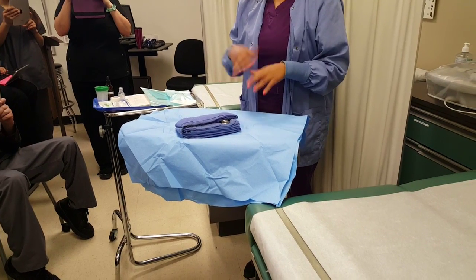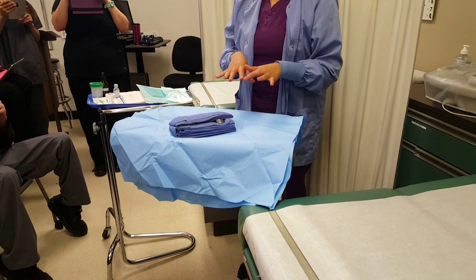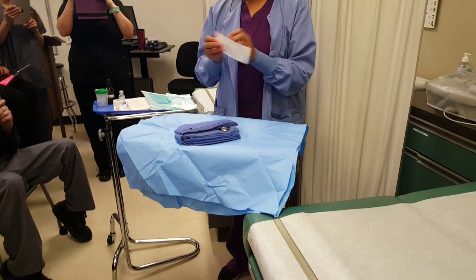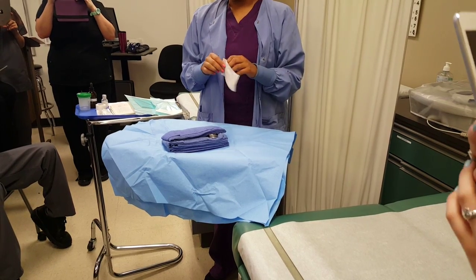There are a couple of things missing on my tray. The first part is opening up my tray and dropping in the items my physician needs that aren't already there — that would be my suture material. You don't need gloves on yet until you start touching the items on the tray.